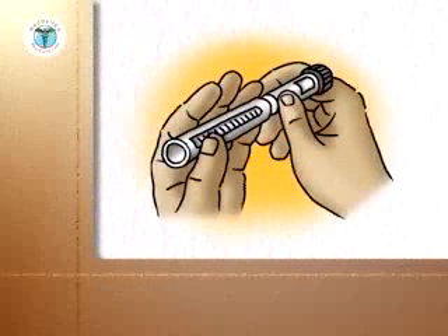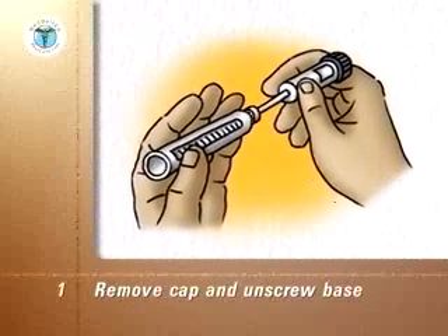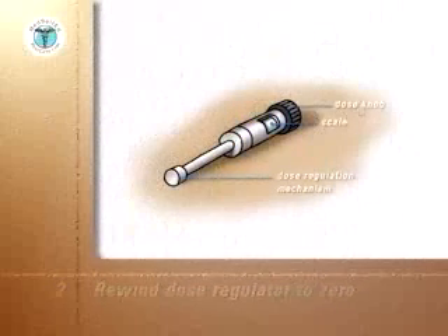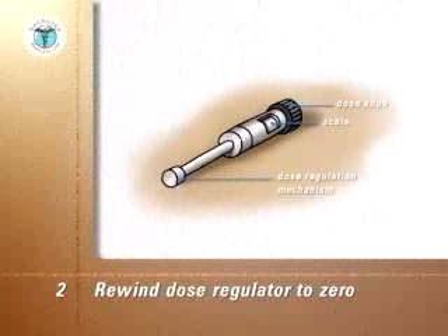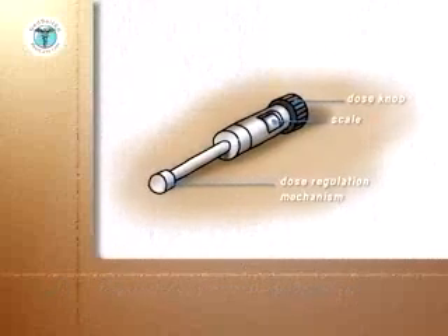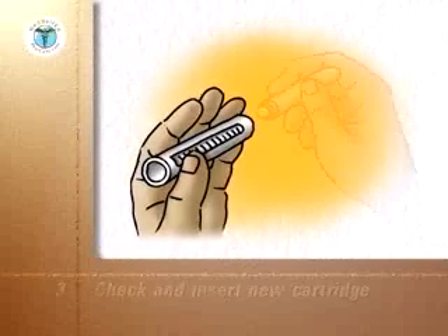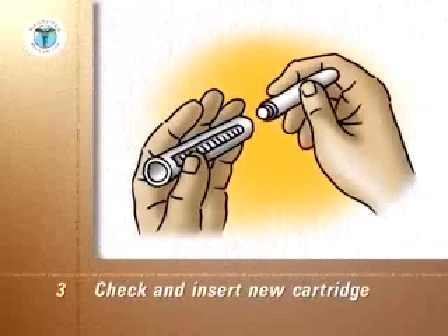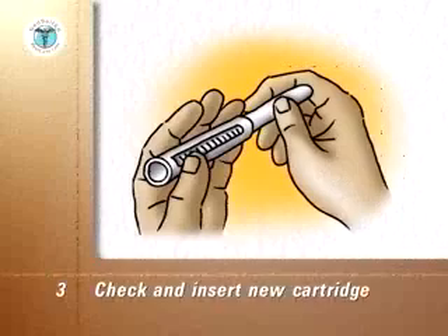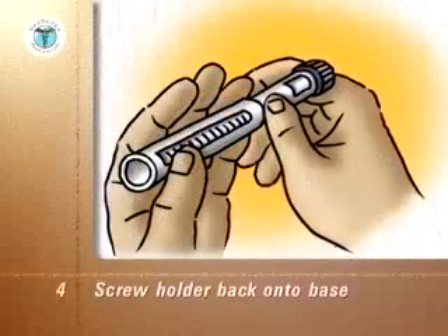Follow the manufacturer's instructions to remove the cap. Separate the base from the cartridge holder by unscrewing it. Rewind the base dose regulating mechanism back to zero and put down the base. Pick up the cartridge holder and shake out the used cartridge. Check that the new cartridge contains the correct insulin and insert it metal end first into the holder. Screw the cartridge holder back onto the base.